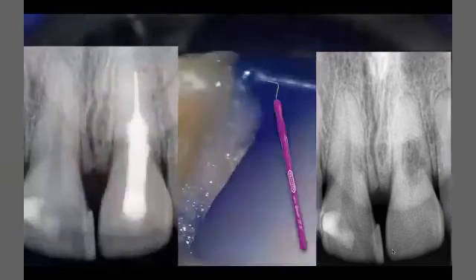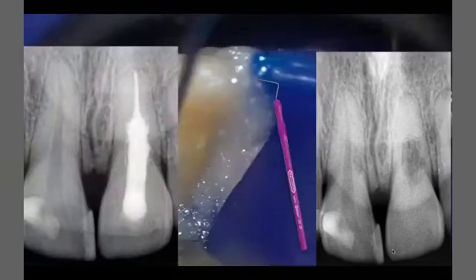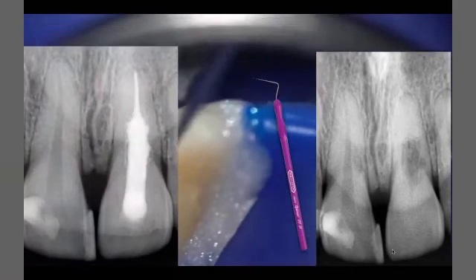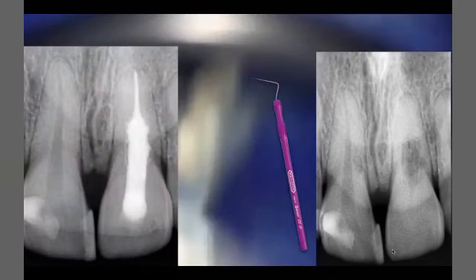Here is the post-op X-ray, and as I told you, I did the filling with gutta-percha and sealer for the internal resorption because there is no communication with the surrounding tissue. So I think this is the final case. Let me check. Yes, the final case for today. I have a slow connection a little bit.